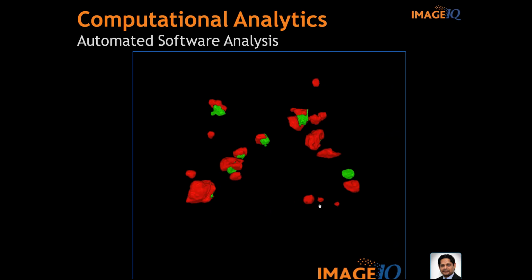What's interesting that you can pick up here is that there's a shift in these tumors, and it's not because the tumor was moving, it's because the patient in this particular case study didn't keep the same breath hold between the 2 time points. And that makes sense in clinical practice. You're not asking them to do that. In a clinical trial, you're probably going to say, keep this breath hold consistent.